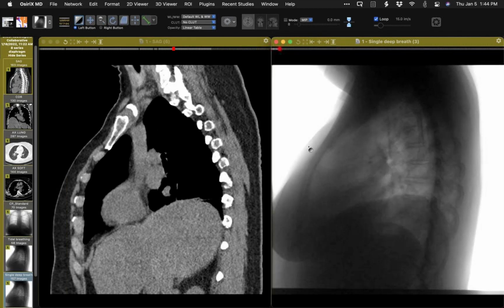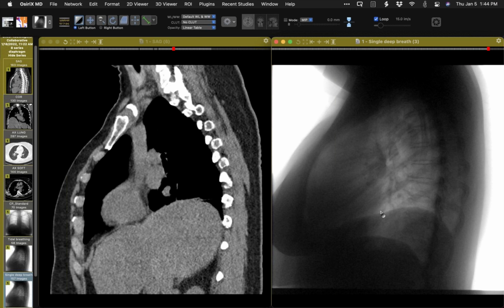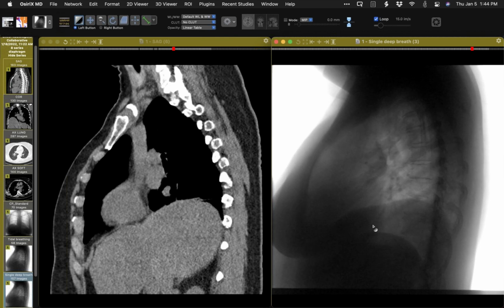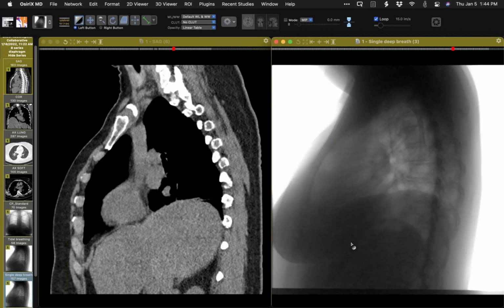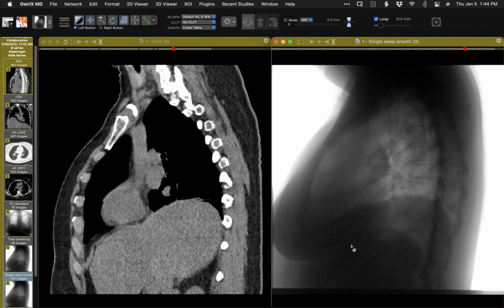So here you can see, I'm going to just scroll through that, and then you'll see that when the patient breathes in, which is going to come up about now, a couple of things. The diaphragm is moving, and it's actually moving very nicely. Even this posterior portion is moving, but the portion that moves very nicely is this more anterior portion that's muscularized. And perhaps as the patient takes a really deep breath in, maybe this portion is kind of dragged downward by virtue of the muscle contracting more anteriorly. But look how nicely that lung inflates overall with one deep breath.